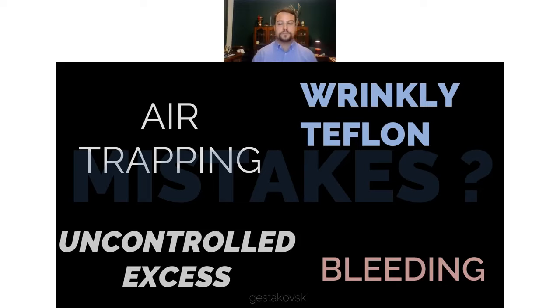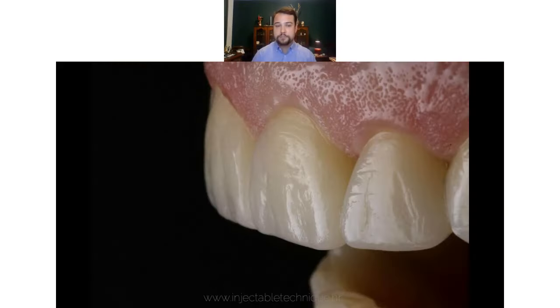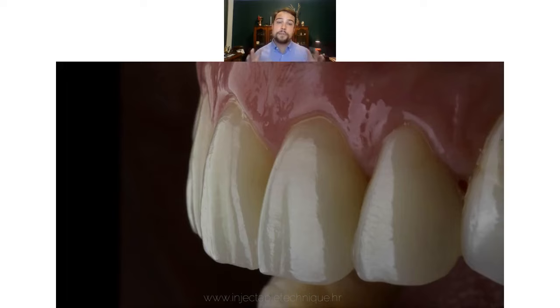Okay. These are some cases that we are showing in detail in the master class, like those 6 veneers. And these are, for example, single shaded veneers. Sometimes we are combining the shades, but in 85% of the cases, you'll be fine with only one shade in achieving a nice aesthetic result. And here you can see all these details are basically captured from the model, from the wax up, and later on delivered directly in the patient's mouth.